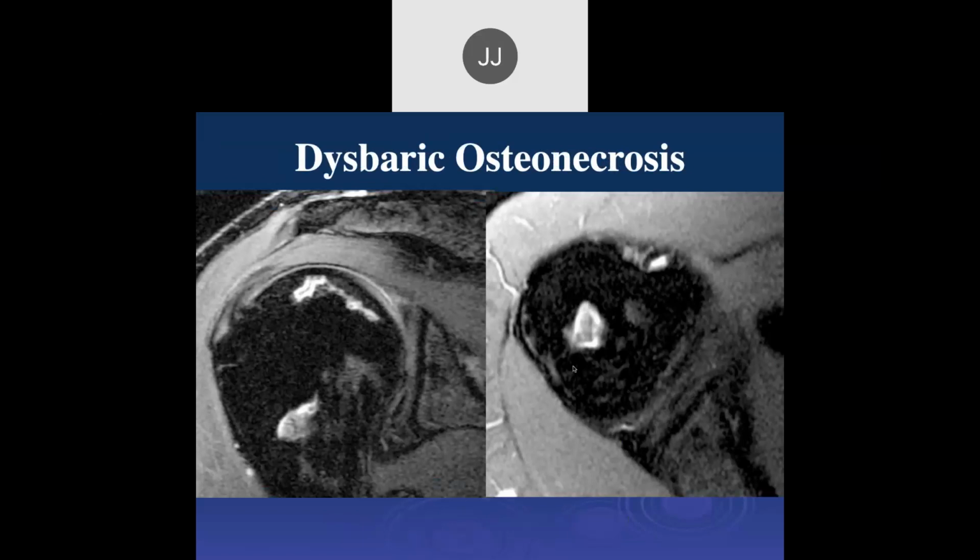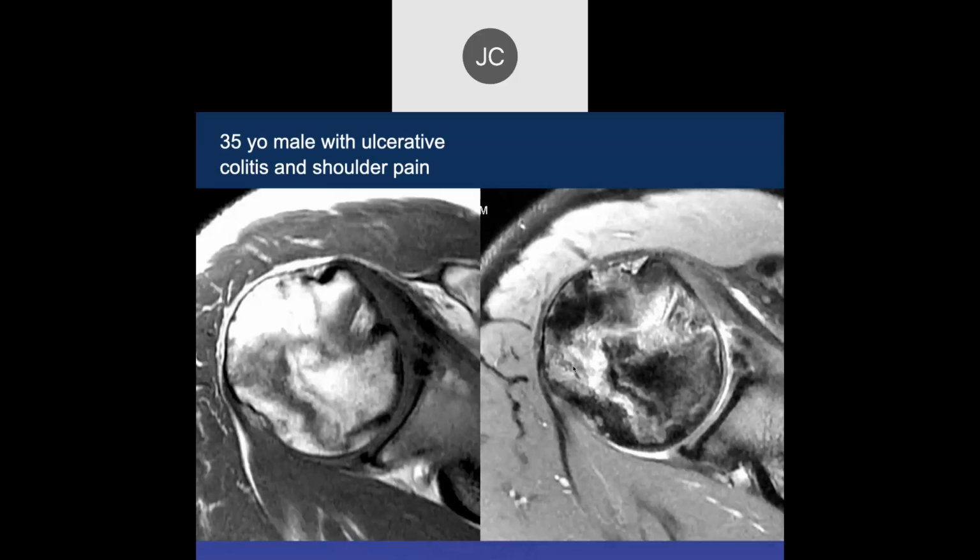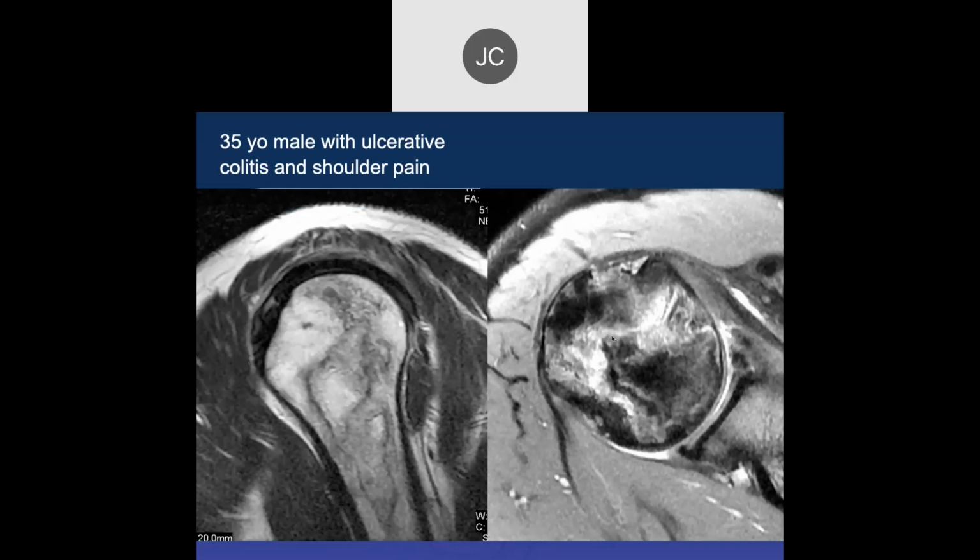Okay, so we have a 35-year-old with ulcerative colitis and shoulder pain, and there's a lot of irregular signal in that humeral head. Again, kind of throughout, in a serpentine type pattern. And this turned out to be avascular necrosis.